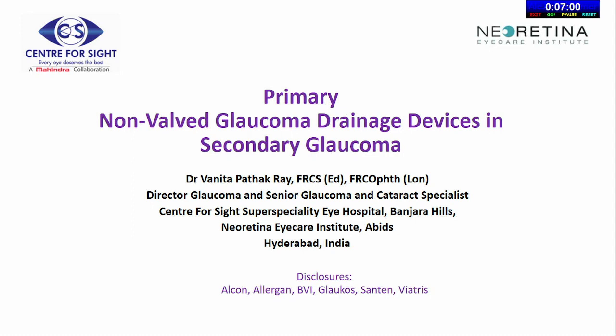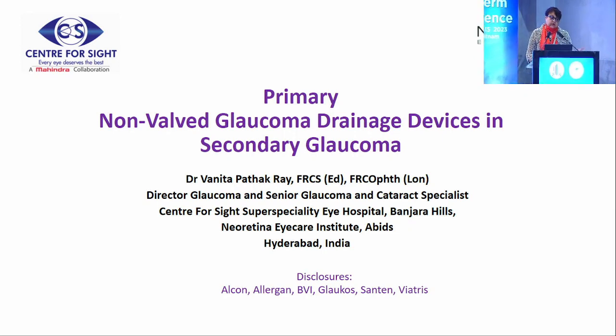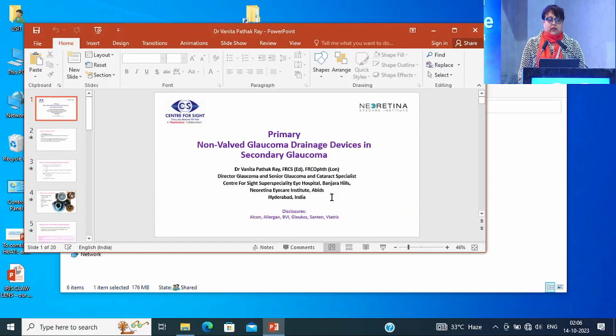Thank you very much, and I'm grateful and thankful to AIOS for this kind invitation. Why do we need GDDs? Basically because we have a group of glaucomas called refractory, which are frequently not controlled with maximum medical therapy, Diamox as well, where surgical management with trabeculectomy, even with MMC, is deemed to be a failure or is anticipated to fail, or in those where TRABs have already failed.